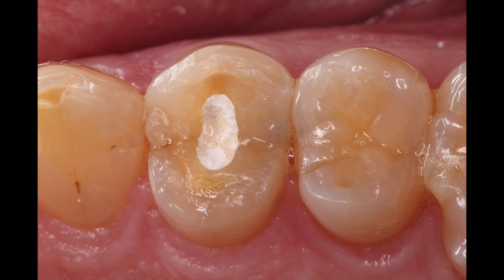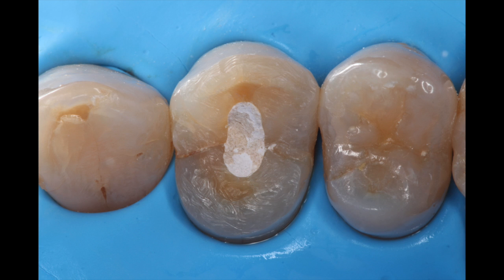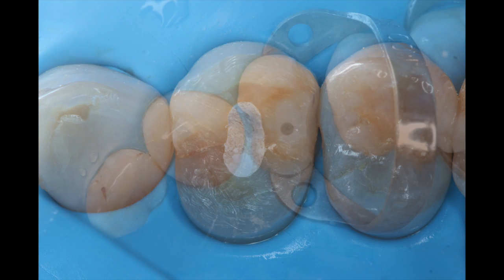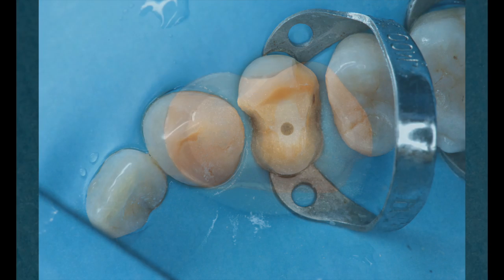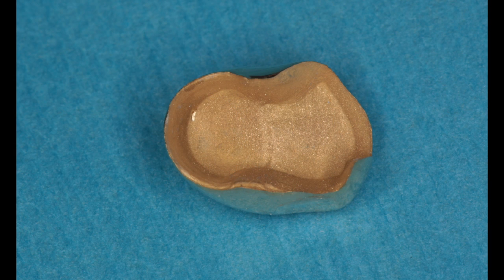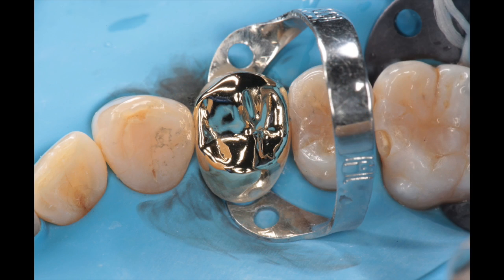We can look at a more recent case — an endodontically treated tooth that had a large vertical fracture. We were basically doing heroic dentistry here. I went ahead and built it up using a fiber post. The restoration has no grooves, just hollow grinds, and then we cemented the restoration.